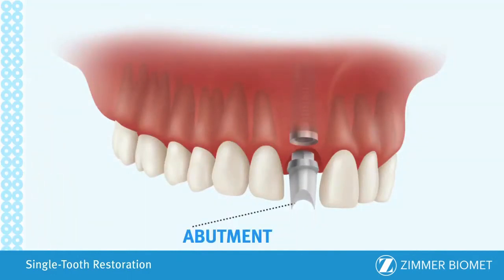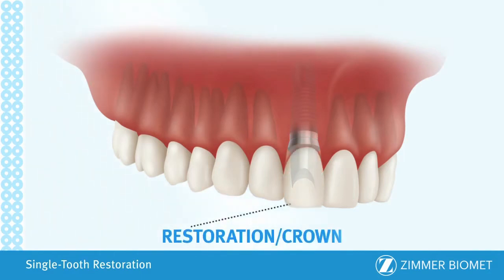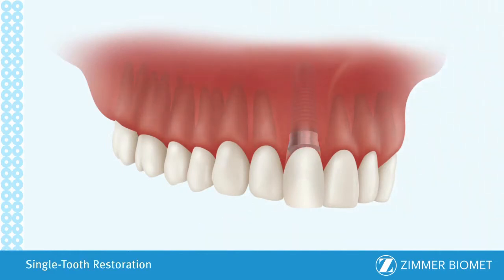The abutment is placed at an appropriate angle to ensure that the restoration is in alignment with adjacent teeth. The replacement tooth, or crown, is cemented or screwed onto the abutment, creating an aesthetic and functional restoration. If you are missing a single tooth, an implant-supported crown may be the best solution for you.